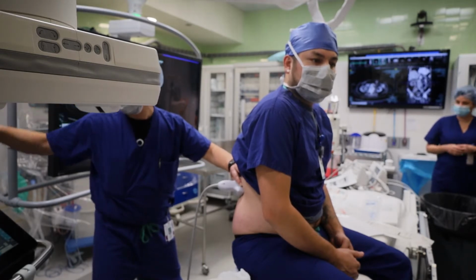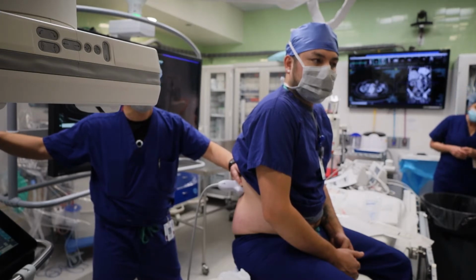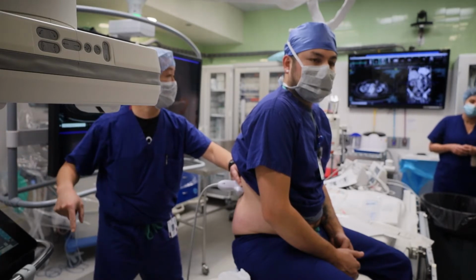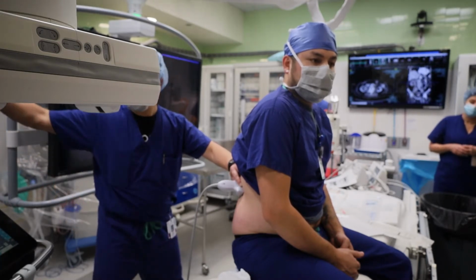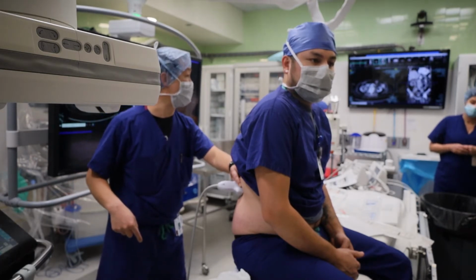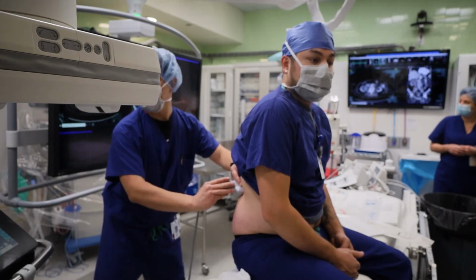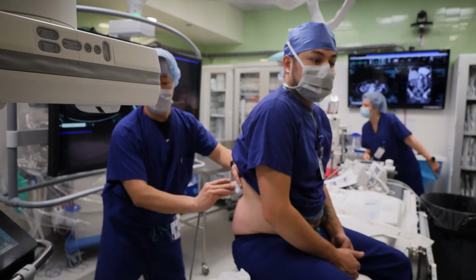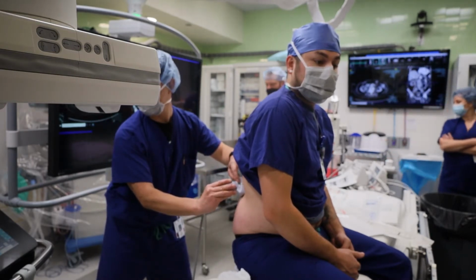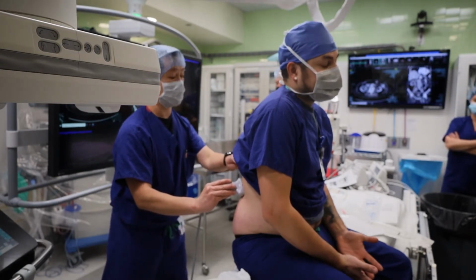This angle is a problem because you see this bright line. Do you guys know what that is? This bright line that's shadowing, that is bowel. And you do not want to put a perc neph through bowel. I've done it. It sucks because then they need surgery to fix that. So you have to move around and figure out what's the best way to do it. If we had to put a perc neph in him, he would be a very difficult perc neph, obviously in this position, okay?